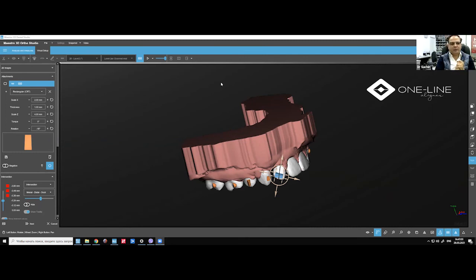But if you want, I mean, the attachment you placed earlier, the yin-yang one, can also move the tooth distally. Yes, you can move it distally. You can also move with this one, but the question remains the same. You have to plan the movement. So as I said, forget the attachment right now. You should just remember the movement first. So if you want to move the crown or the root altogether, you can actually make a tip. Yes, you can make a tip.